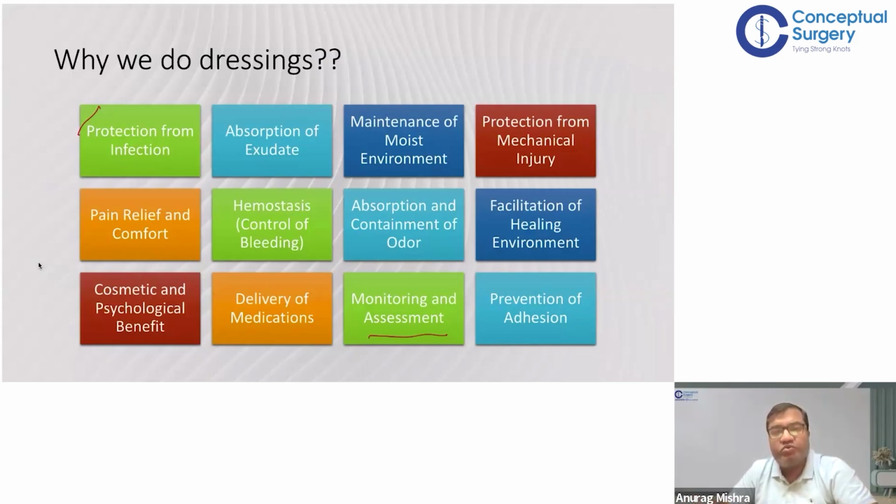Now, whenever you do a dressing, you should understand what the main purpose is in that particular case, and then accordingly your dressing should be able to provide the answer to that. Let's say you're doing it to make it cosmetic and your dressing is not very cosmetic, then you can understand that the purpose is not fulfilled. The dressing should look good, should look decent. So that is the purpose of dressing.